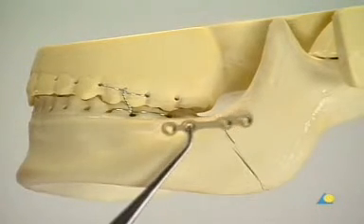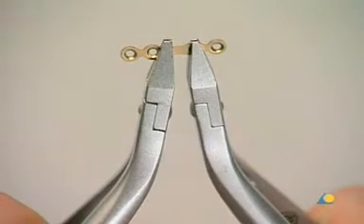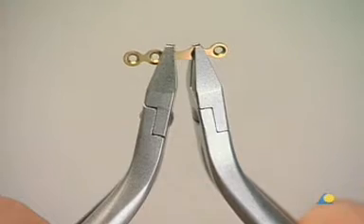A 2.0 mandible mini plate with center space is placed near the upper border of the mandible. When choosing the plate, it must be considered that at least 2 screws are needed for each main fragment, and that sufficient distance be maintained between the fracture line and the closest screw hole. The plate is contoured with bending pliers to match the anatomy.